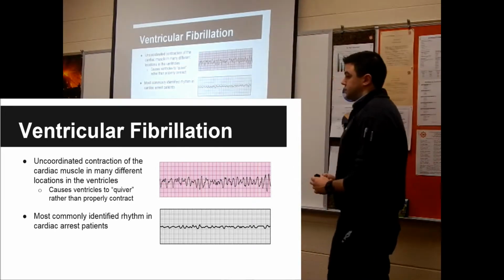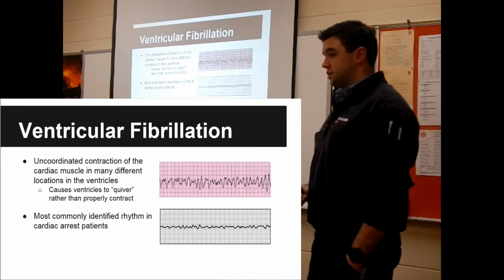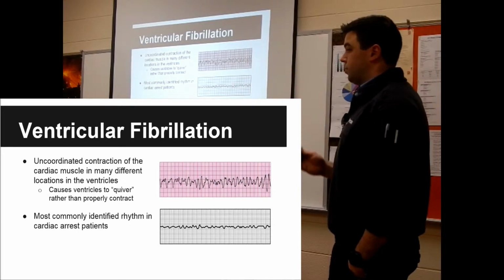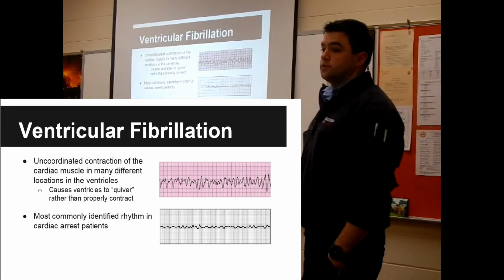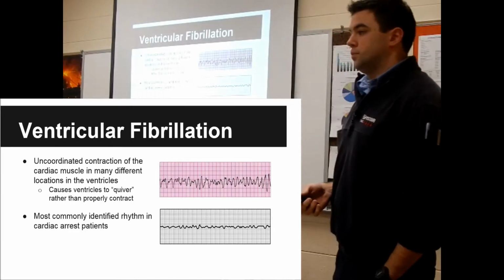In Seattle, Washington, King County, they have an over 50% success rate with defibrillation in getting ROSC. That's with a witnessed arrest going into Vfib. What's ROSC? Return of spontaneous circulation. When you get the pulse back.